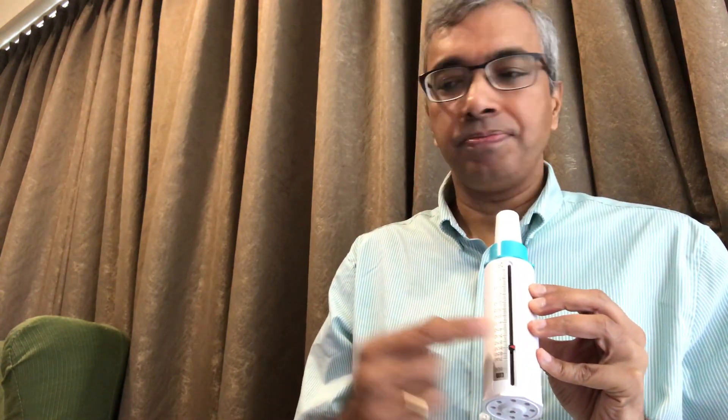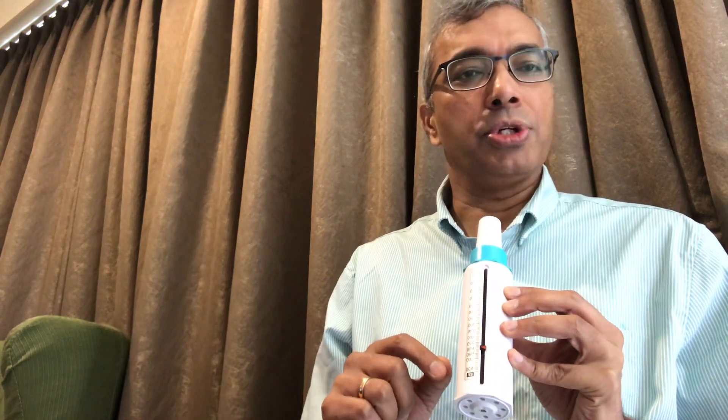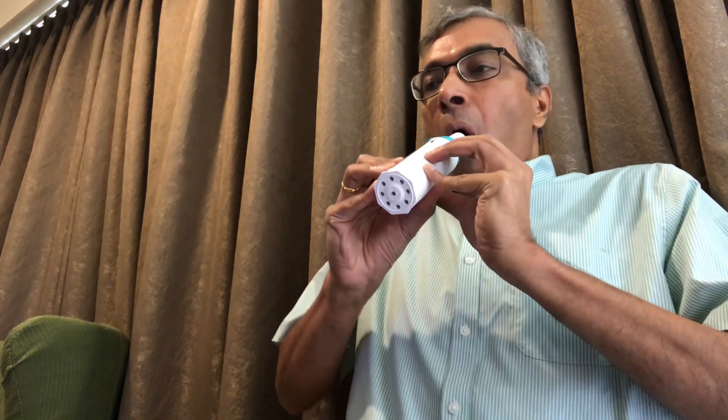Note down the reading and maybe do it two more times in the same way — take the lever back, take a deep breath in — again note it down, and the best of the three readings is your reading.